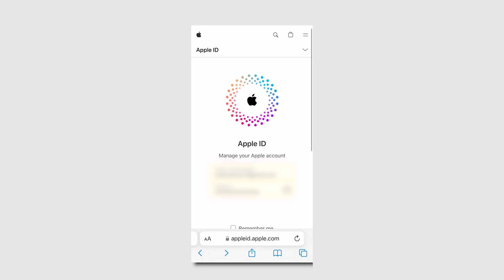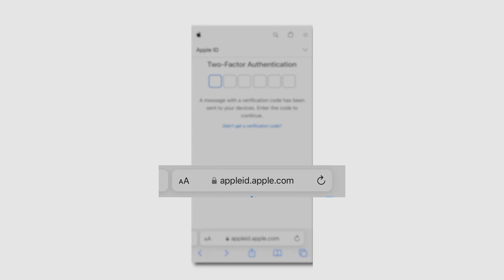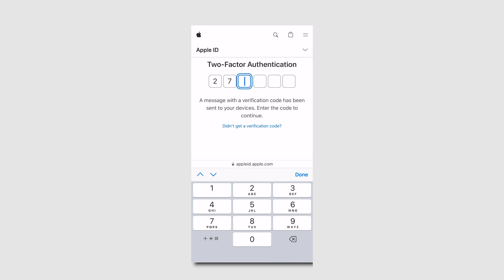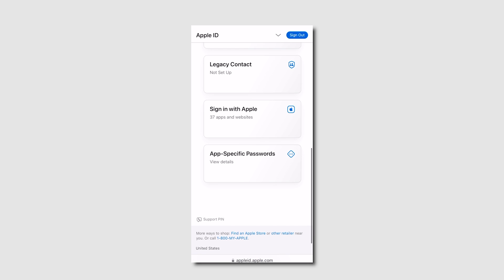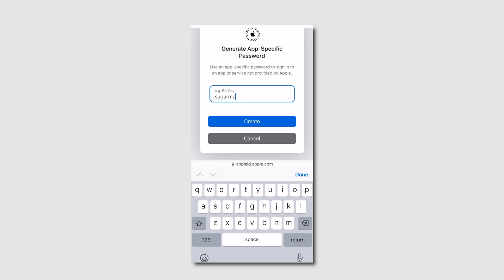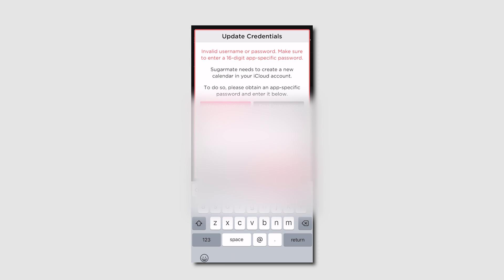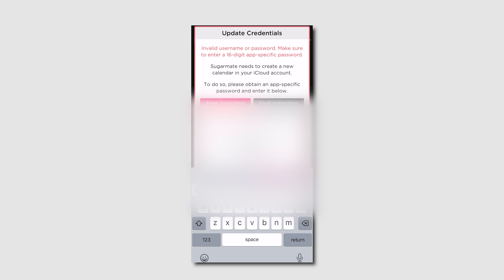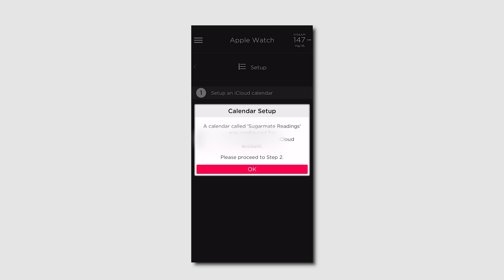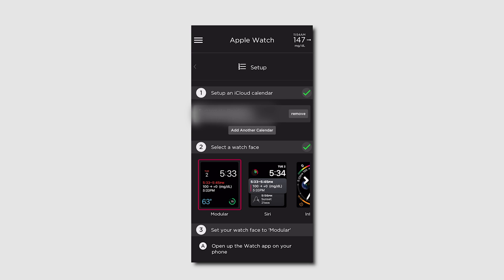Open up a browser on your phone or computer and go to AppleID.Apple.com, then sign in using your Apple iCloud username and password. It will most likely have you enter a two-factor authentication code, which will be sent to all your Apple devices. Once you're logged in, scroll all the way down to App-Specific Passwords and tap there. Generate a password — you just have to give it a name; I called mine Sugarmate. Copy the password it created, open Sugarmate, fill in your Apple ID email, and paste that app-specific password below. Sugarmate should now be connected to your iCalendar and be sure that the Sugarmate calendar is checked on on your devices.